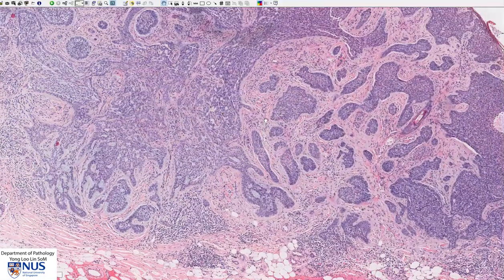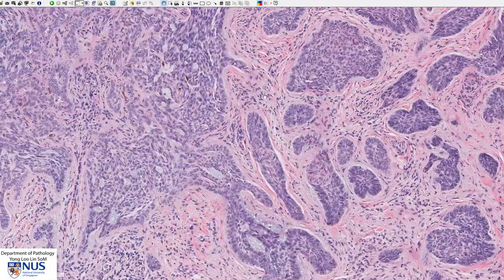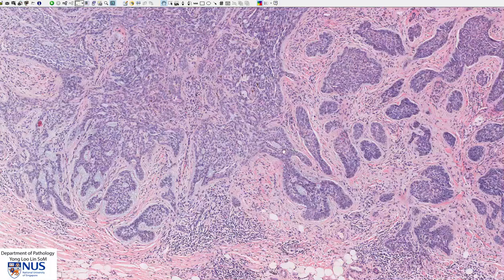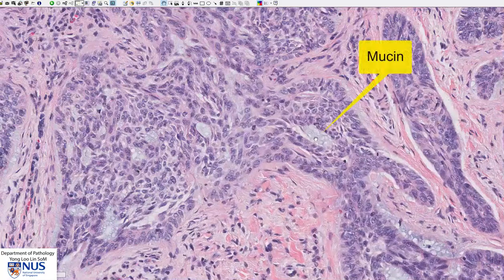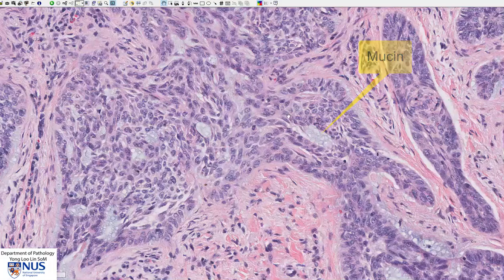The stroma is fairly desmoplastic with proliferation of these spindle myofibroblastic cells. In some areas, we can also see this grayish, bubbly-looking material. And this is mucin, which is quite commonly seen in basal cell carcinoma.